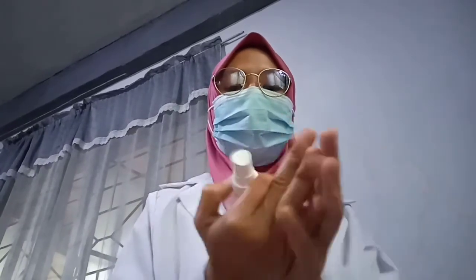Removing PPE properly reduces the risk for infection transmission and contamination of other items. Hand hygiene prevents the spread of microorganisms.